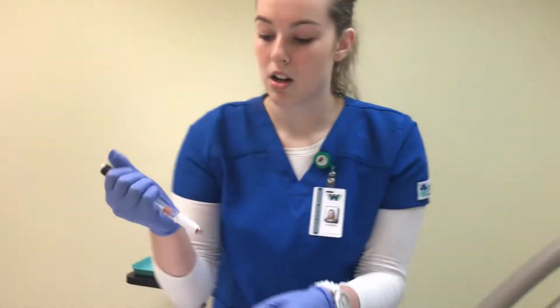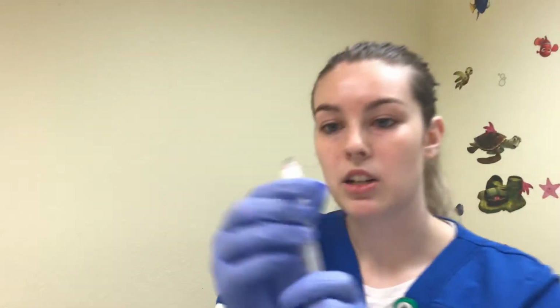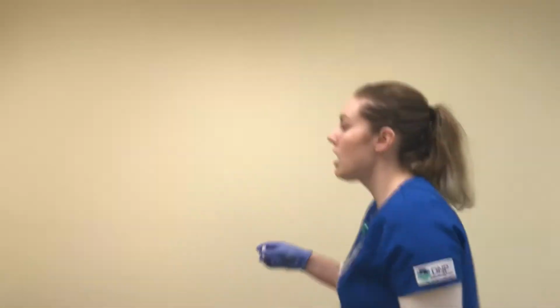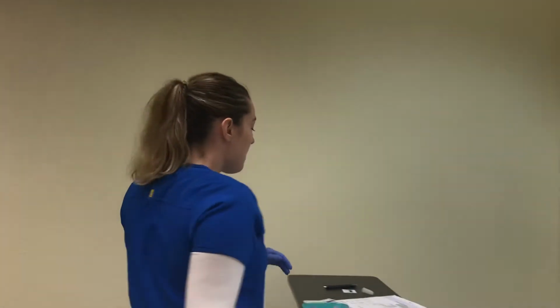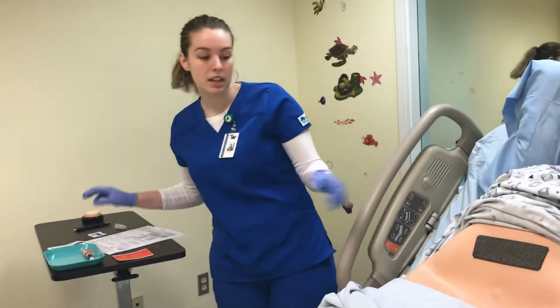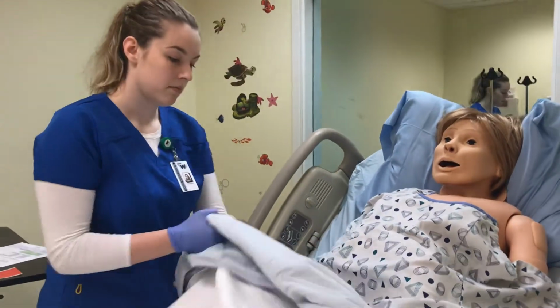Good. Okay, Shirley. So now you can see that my safety is on from the red on the needle, so I can just uncap that. And I can put it in the sharps container. And then I would clean up her stomach if there's anything, and pull down her gown and pull back up her sheets.